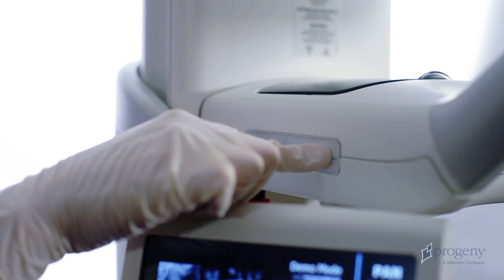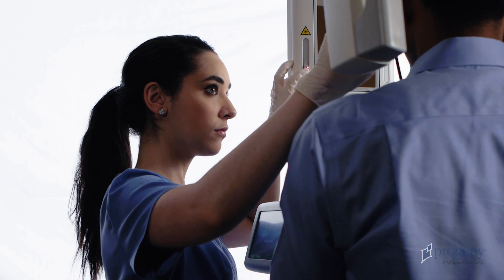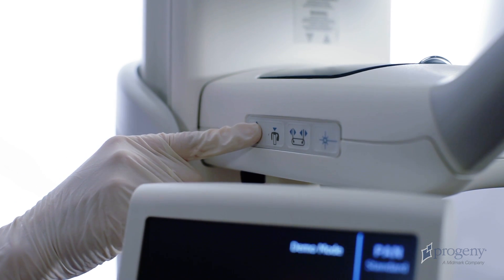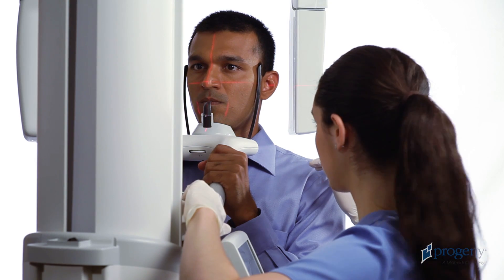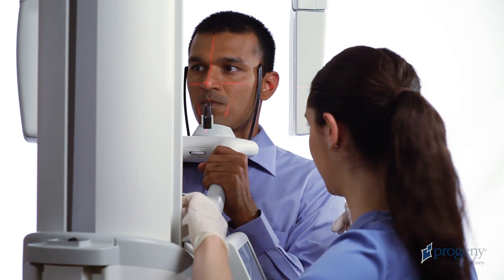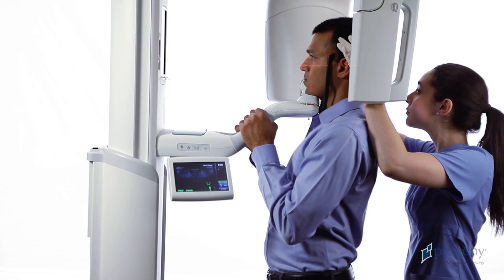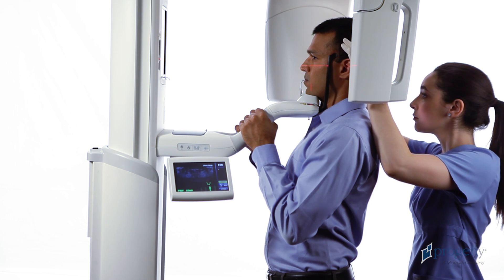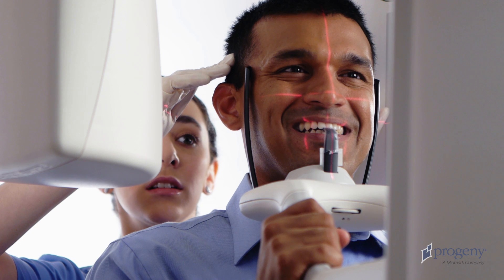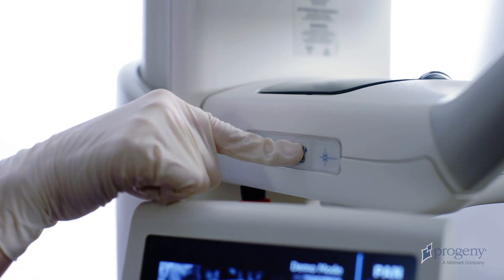Align the patient's head. Begin by drawing the Frankfurt plane laser up to align with the base of the patient's orbit and the top of the ear canal. Use the height of the positioning table to tilt the patient's chin higher or lower, bringing the Frankfurt plane horizontal. Move directly behind the patient and gently rotate their head to align with the projected mid-sagittal laser. Be sure to observe alignment from front to back as well as from top to bottom. Close the head support wands.